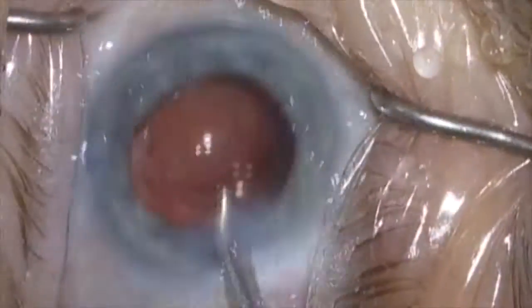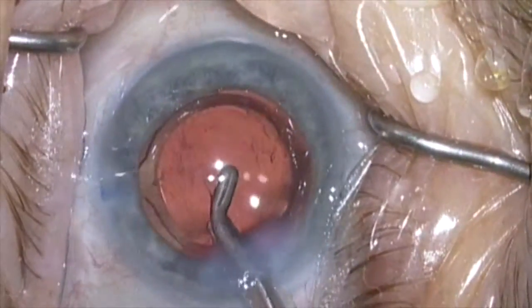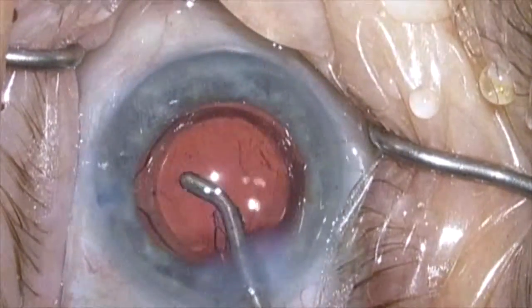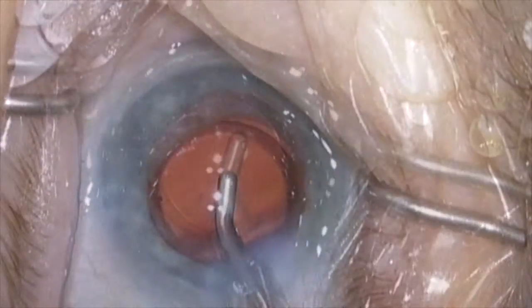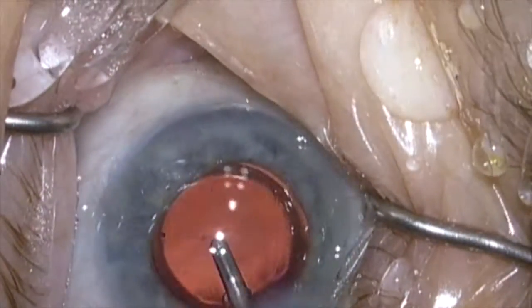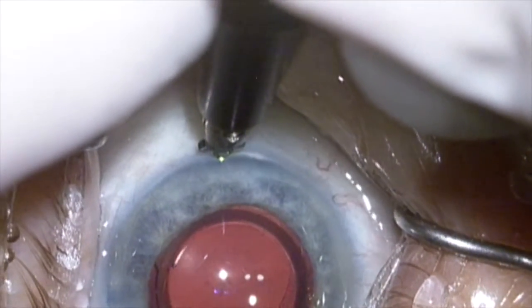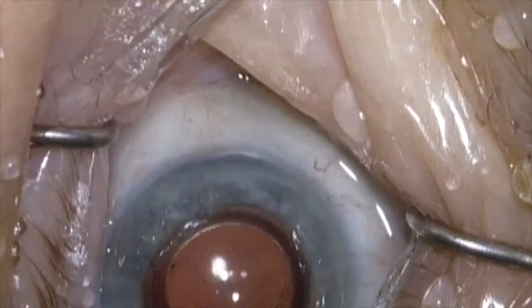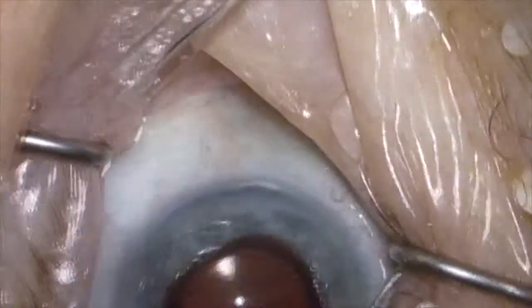I'll now remove the residual viscoelastic. A limbal relaxing incision will then be carried out. This patient is 95 years old, so we don't want to be too aggressive with the LRI — we're only correcting about three-quarters of a diopter — and the case is completed.